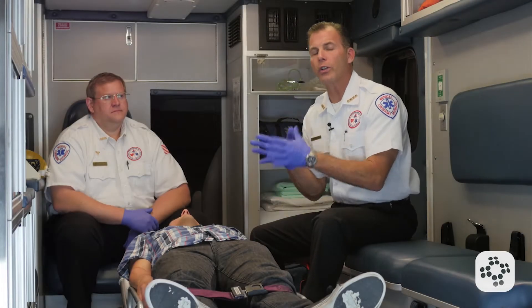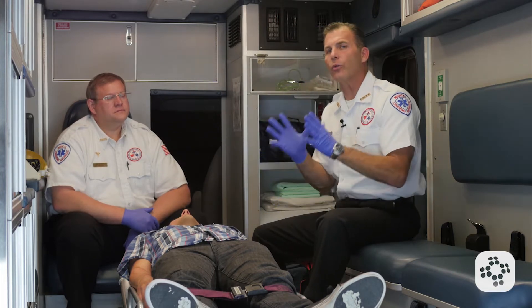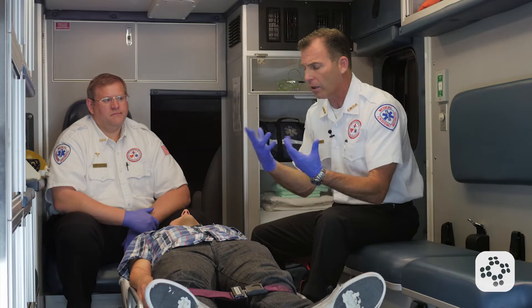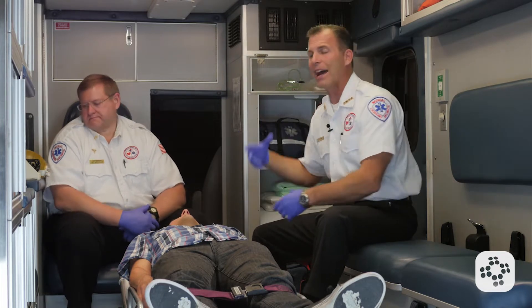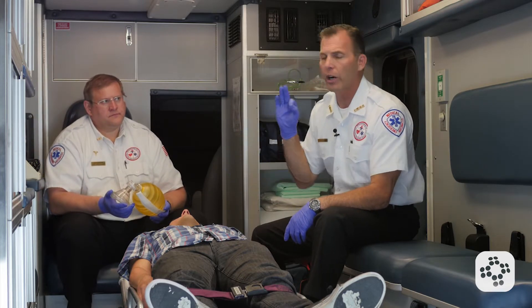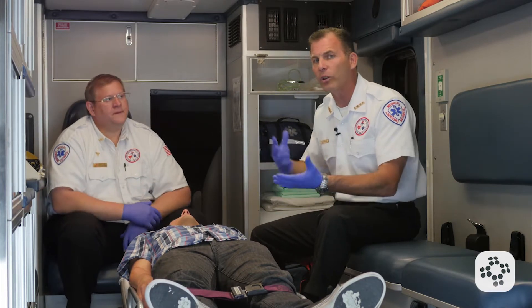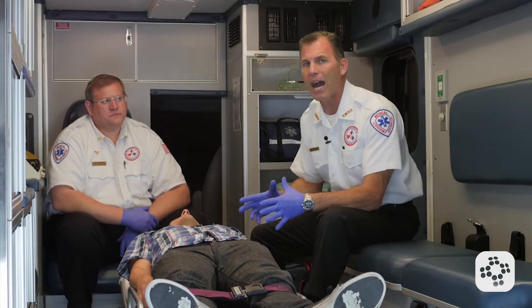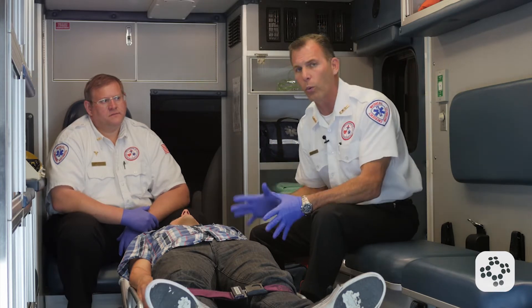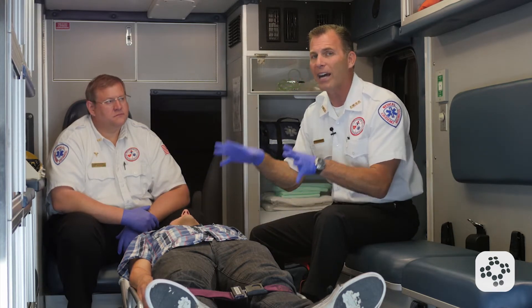Now let's cover two-rescuer adult AED for the healthcare professional. We're still going to check the scene for safety — not just for the rescuers, but also for the usage of the automated external defibrillator. Our gloves are on, and we have a bag valve mask that my second rescuer will be using. There are no combustible gases or liquids, and the patient is not lying in a pool of water that would connect either rescuer to the patient's body so that when we defibrillate them, we may also be electrocuted. If they were, we would move them to dry ground and pat off their chest to make sure it's dry enough that the pads would adhere.